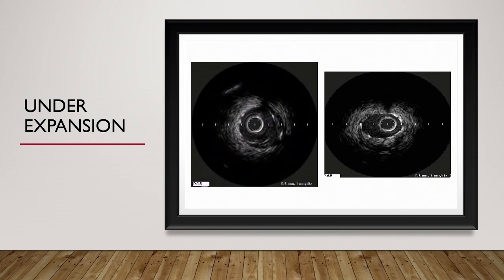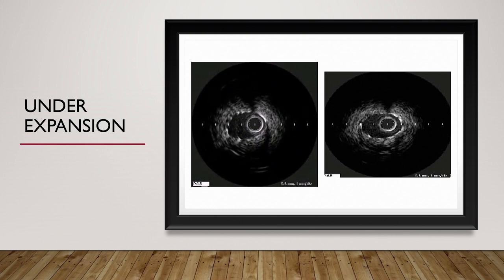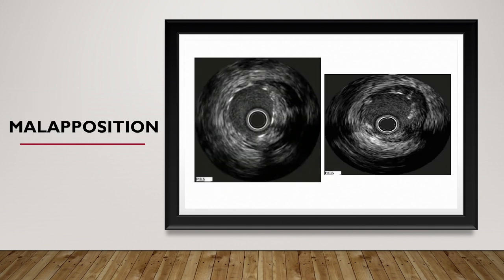Look at this vessel size and look at the stent size. You can see such a small stent. This is an undersized and under expanded stent. The stent can further expand. If you calculate the expansion of the stent, it will be less than 70%. So the optimal stent expansion should be more than 80%, ideally 90%, matched to the distal and proximal diameter of the vessel.